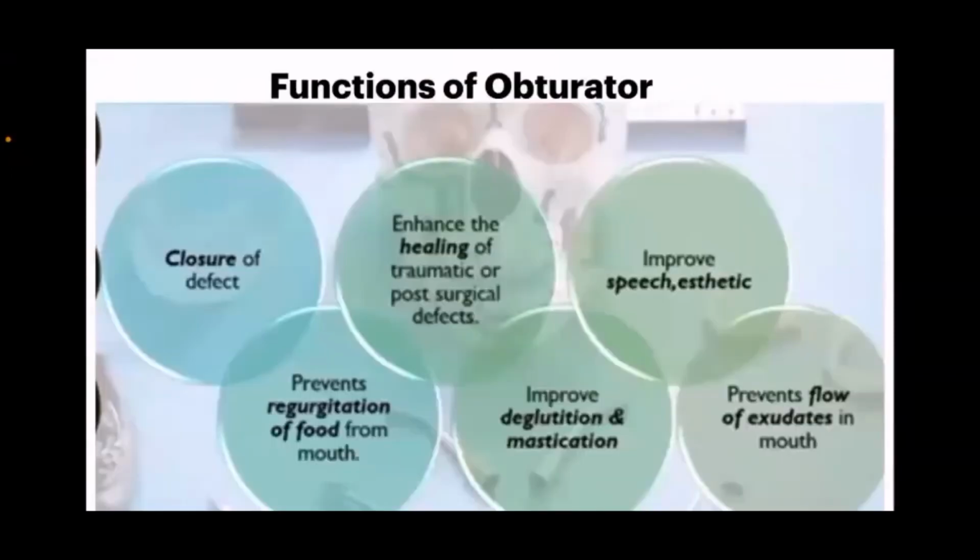Functions of obturator: it helps in closing of the defect, enhances the healing of traumatic or post-surgical defects. It improves the speech and aesthetics, prevents regurgitation of food from mouth, improves deglutition and mastication, and it prevents the flow of exudates in the mouth.